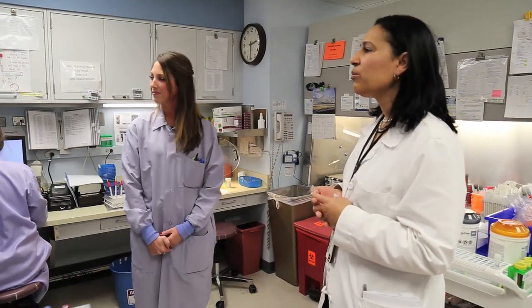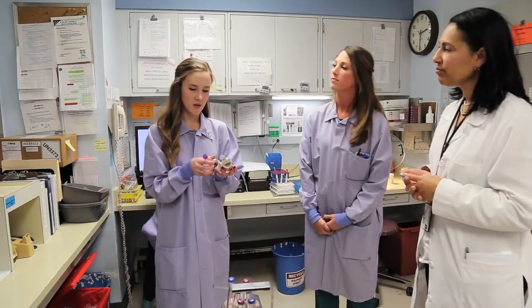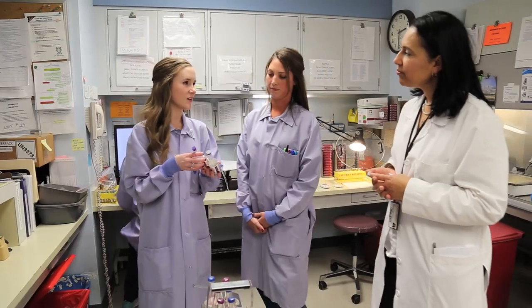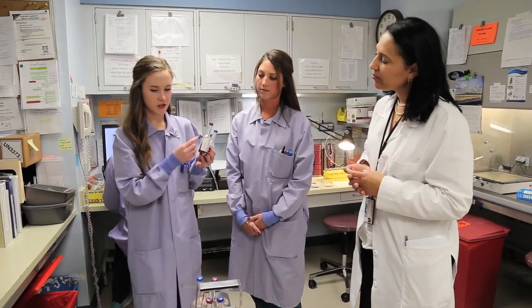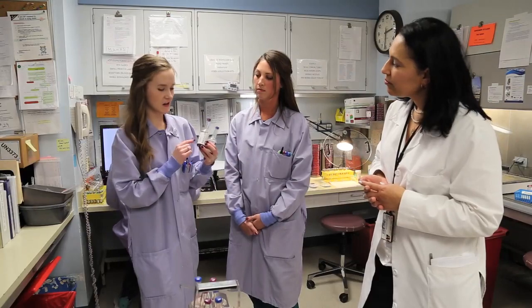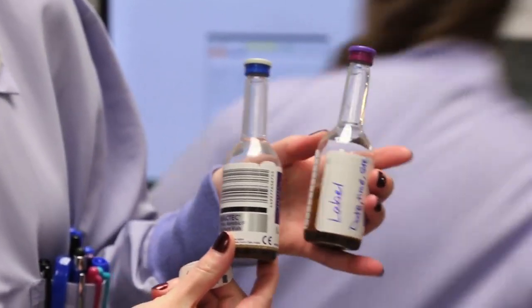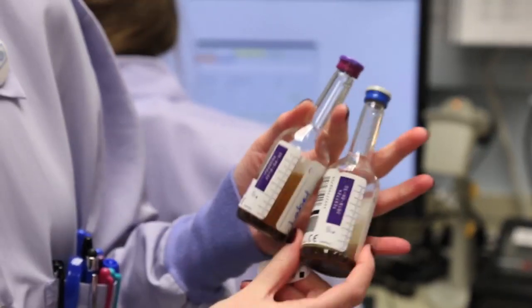What about labeling? Any concerns with labeling or any problems with that? So blood bottles are a big thing. Depending on where you put the label, it can make it easier or harder for us. There are these spots on these bottles. When you put the patient label on it, it will look like this. It doesn't have any patient info on it right now. But you want to put it here where it's not covering up this barcode or this sticker, because we're going to need to remove this sticker later.